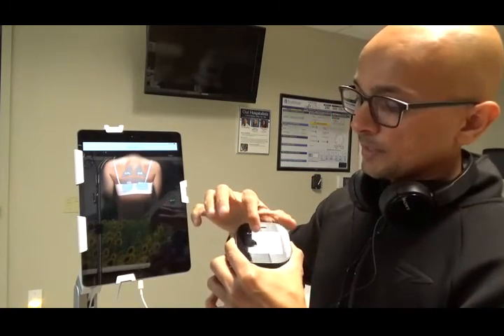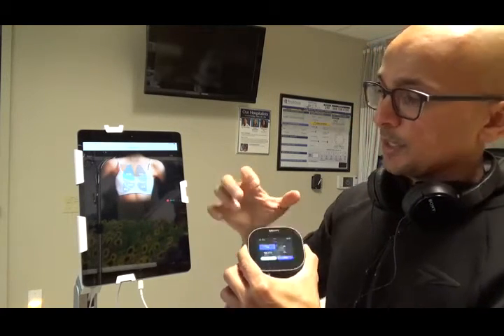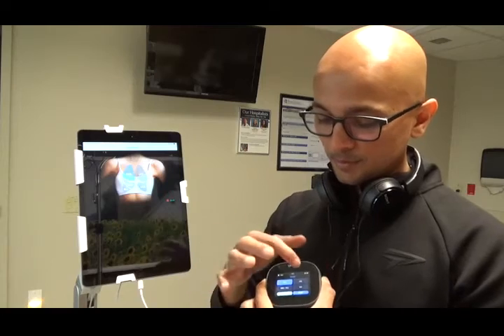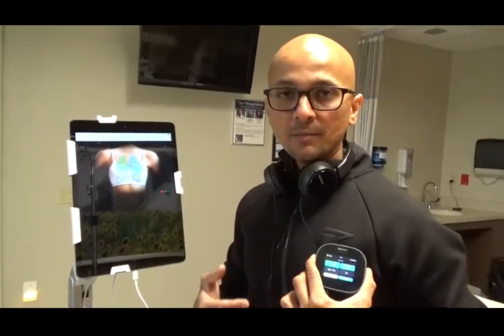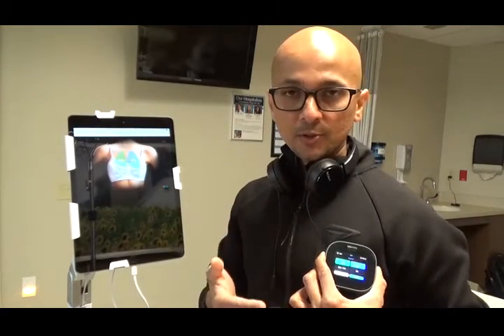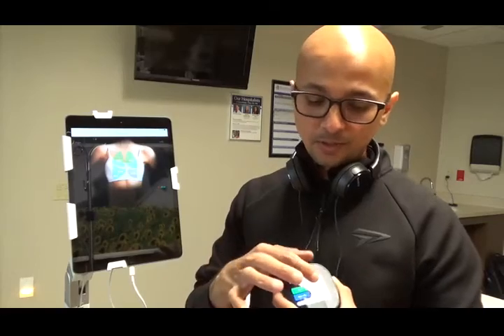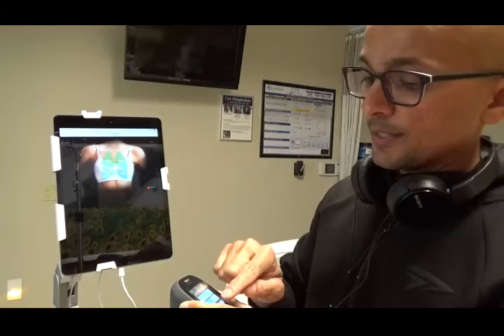And let's say you have the back. In my case, I'll just go back to the front here, but then I'll choose right upper. So now you know what you're auscultating. Same thing as the heart. You choose the section, you auscultate the section, right? Left upper, obviously deep breath in and out, and like I said, at least try to go directly to the skin versus obviously a sweatshirt. And the maximum I would say would just use maybe a t-shirt, but that's about it, right? And you could click done once everything is auscultated.